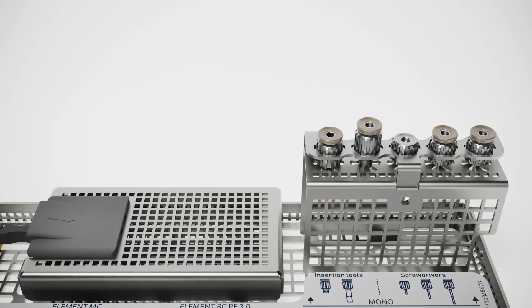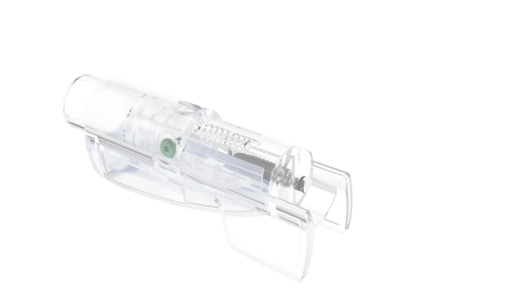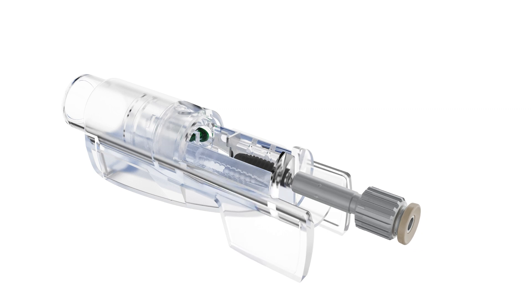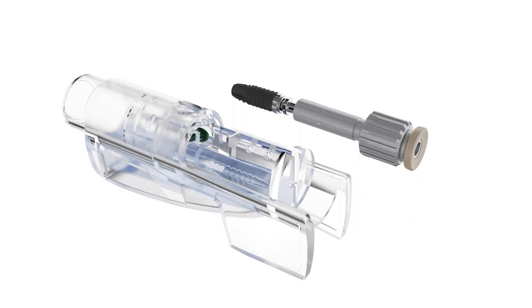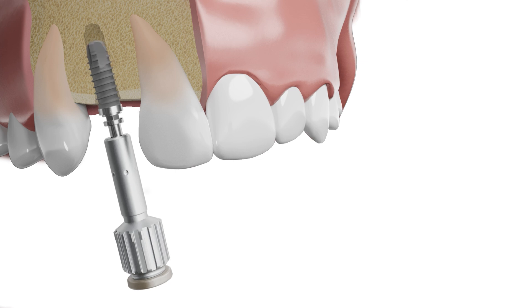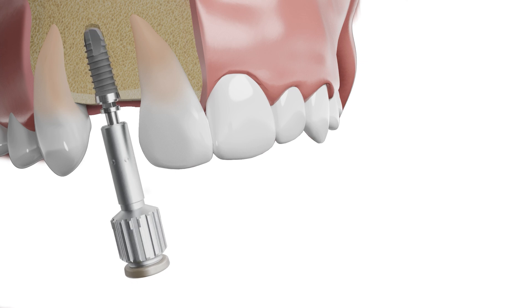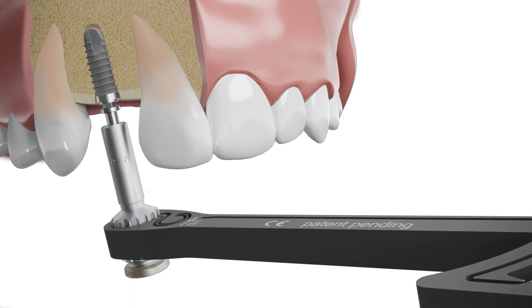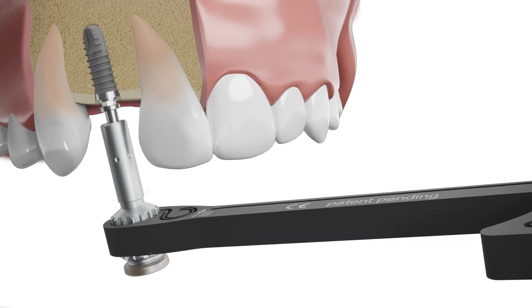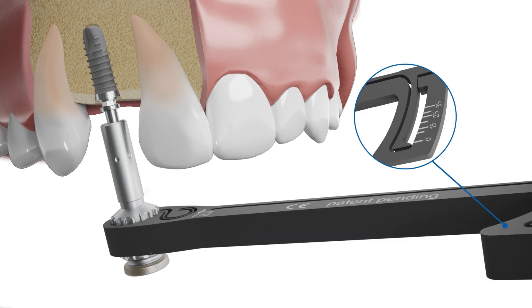For manual implant insertion, screw in the implant with the mono insertion device to the point where the implant is seated firmly in the bone. Continue working with the mono-torque ratchet. Screw in the implant with slow movements of the ratchet. Use the bending rod to display the exerted torque.